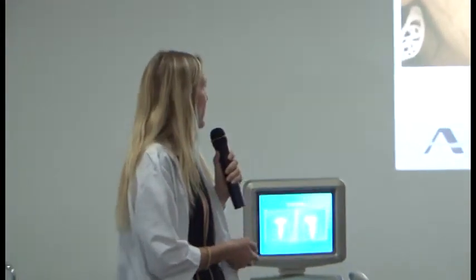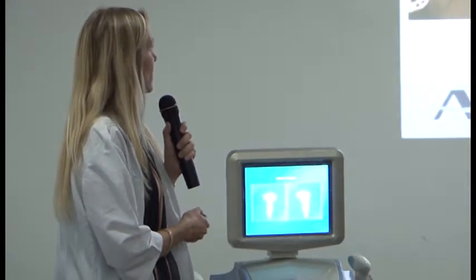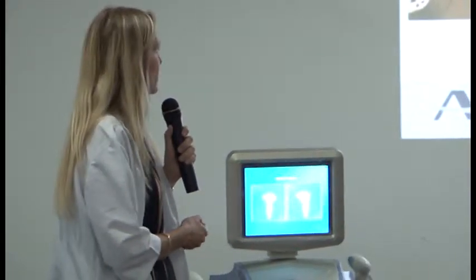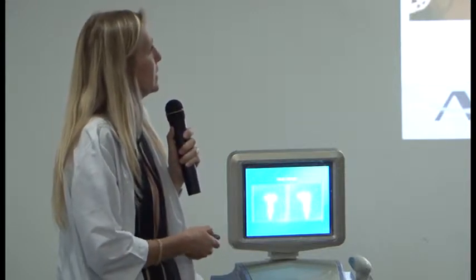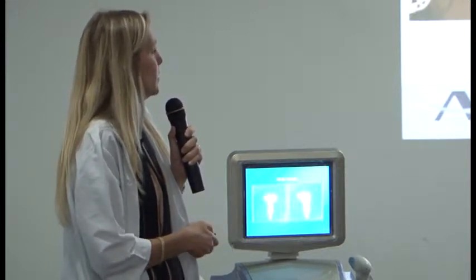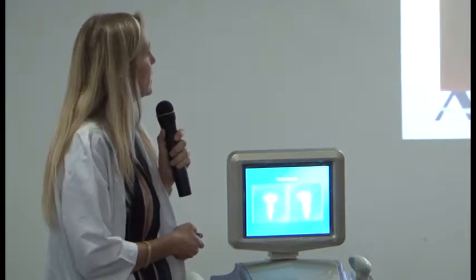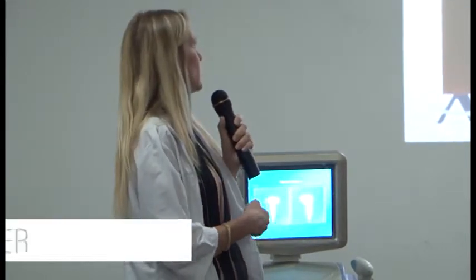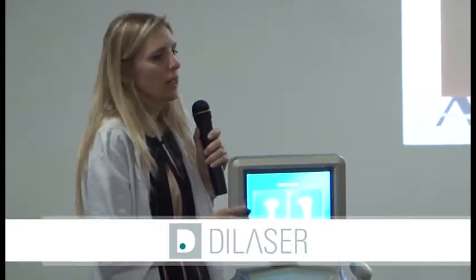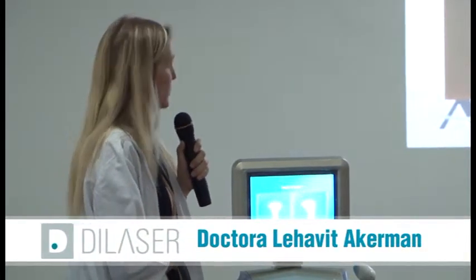This is a younger patient. She has a little bit of acne scars and a little bit of pigmentary dyschromia here, and you can see that after 2 treatments, improvement both in the scars and in the pigment situation. This is a case of very, very severe acne scars. This is one of the cases which I'm working at higher powers, higher than 40 watts. You can see that she improved after 5 treatments.